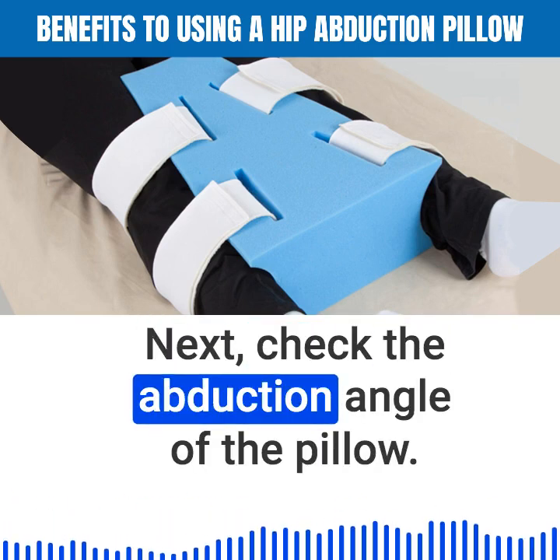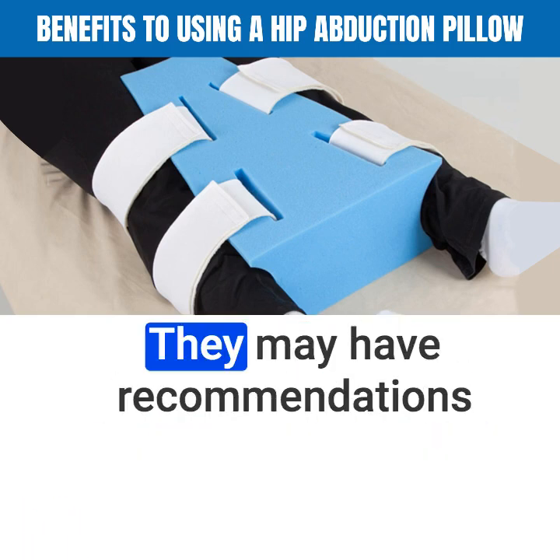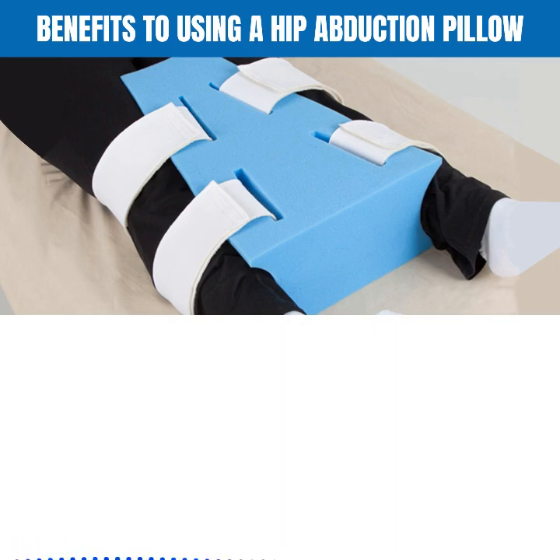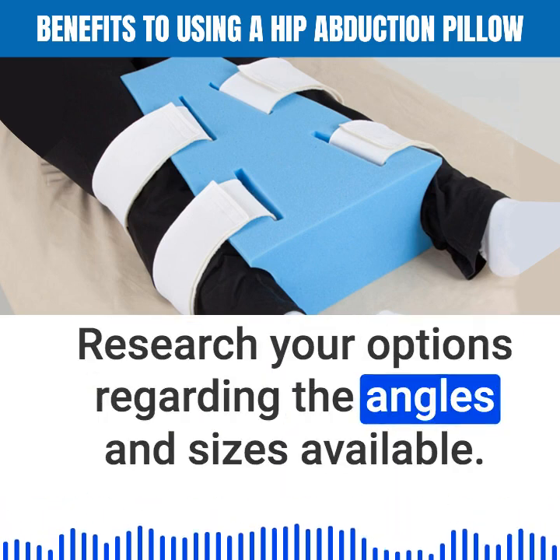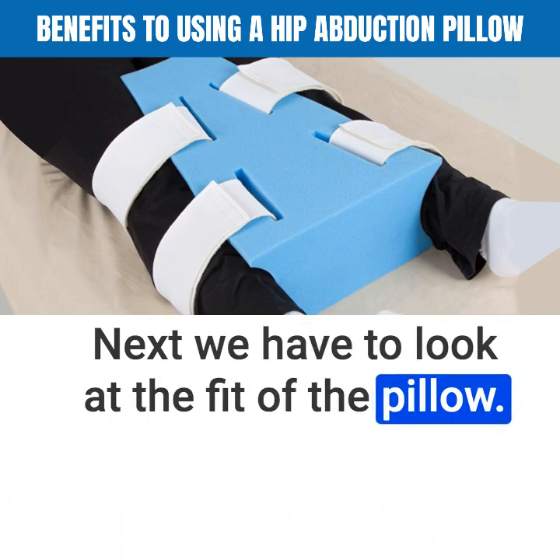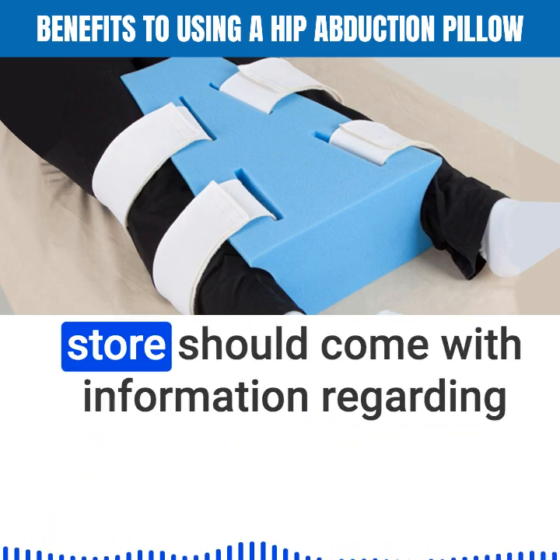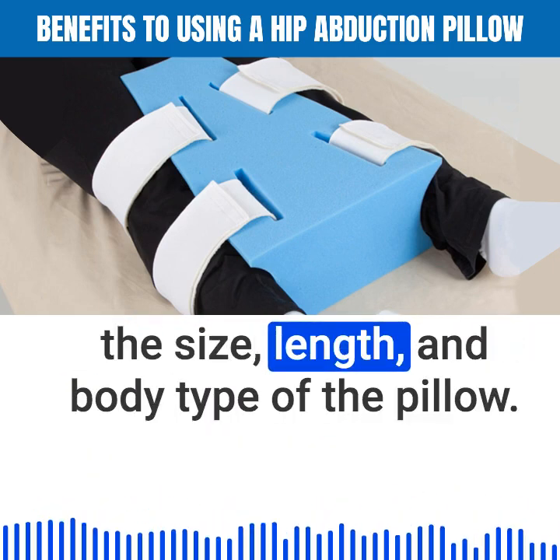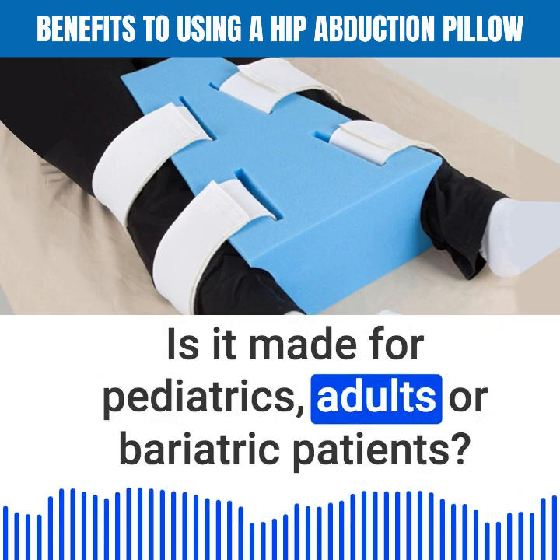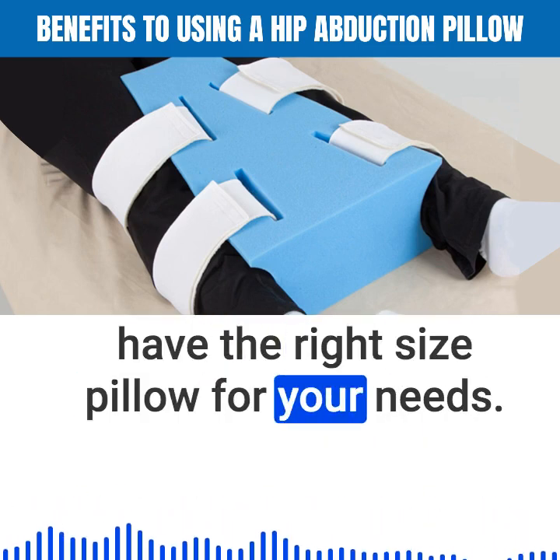Next, check the abduction angle of the pillow. Talk to your doctor before settling on an abduction angle, as they may have recommendations about how far apart your thighs should be. Research your options regarding angles and sizes available. Also look at the fit of the pillow — each pillow should come with information regarding size, length, and body type. Is it made for pediatrics, adults, or bariatric patients? This is important to making sure you have the right size pillow for your needs.